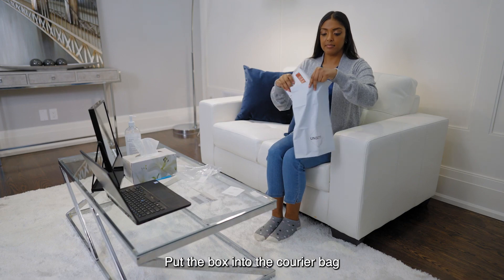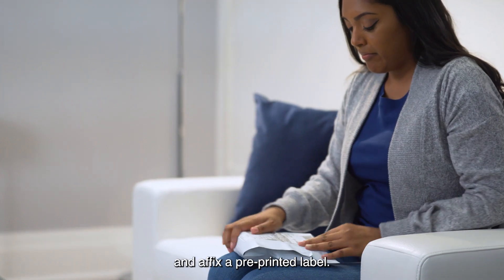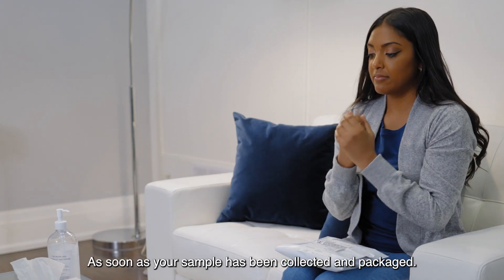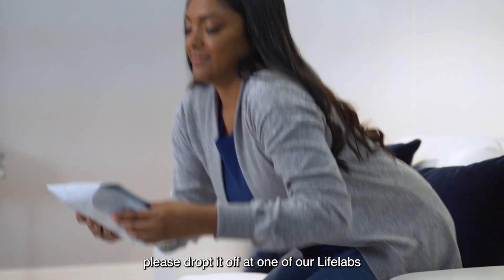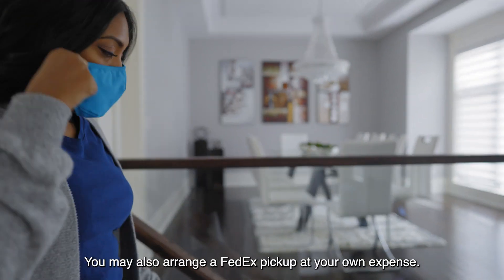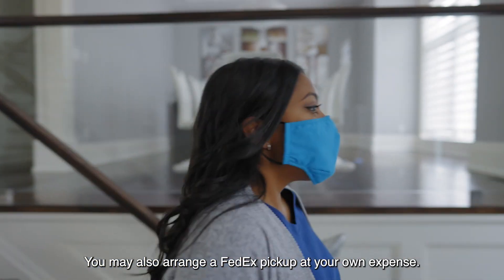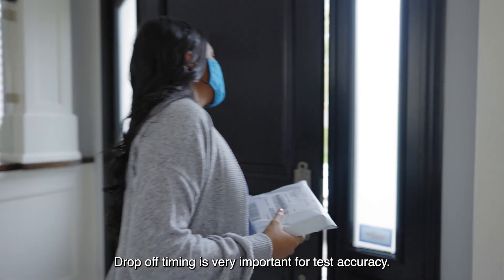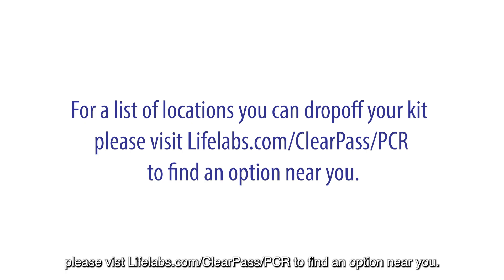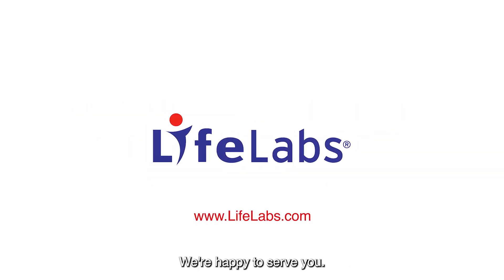Place the pouch in the kit box and seal it with the tamper-proof tape. Put the box into the courier bag and affix a pre-printed label. Sanitize your hands. As soon as your sample has been collected and packaged, please drop it off at one of our LifeLabs patient service centers during regular operating hours. You may also arrange a FedEx pickup at your own expense. Drop-off timing is very important for test accuracy. For a list of locations, please visit lifelabs.com/clearpass/pcr to find an option near you. Thank you for choosing LifeLabs — we're happy to serve you.